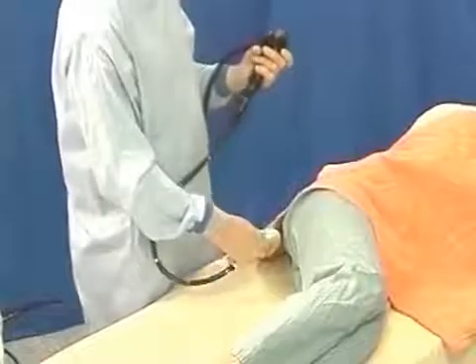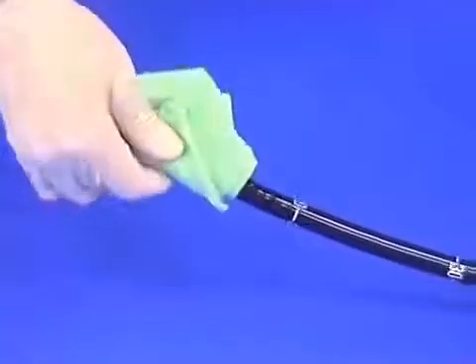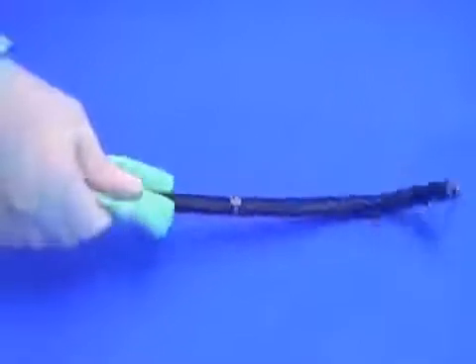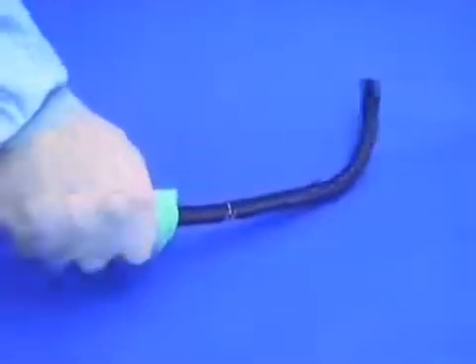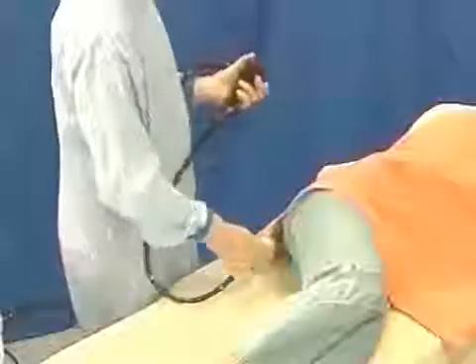Working single-handedly, the right hand holds the shaft in a gauze or towel for hygiene, and so that the fingers can apply twist. Using the fist is much more ungainly, less effective, and loses the feel and delicacy of finger grip.